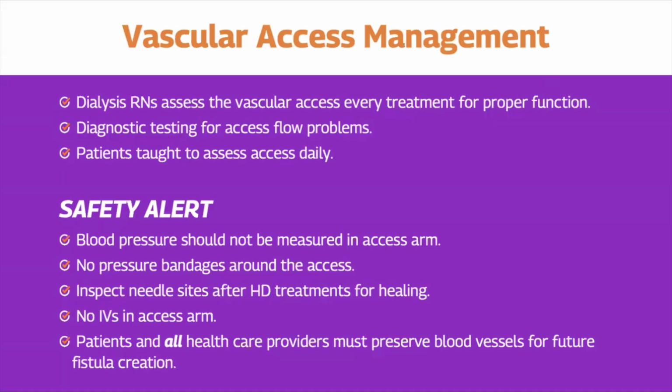Generally, we want the Band-Aids or the dressing on a vascular access like a fistula or graft to be removed 4 to 8 hours after treatment. You don't want to leave those Band-Aids on until their next dialysis treatment. We don't ever want to put IVs in that access arm, and patients and all healthcare providers must preserve blood vessels for future fistula creation.